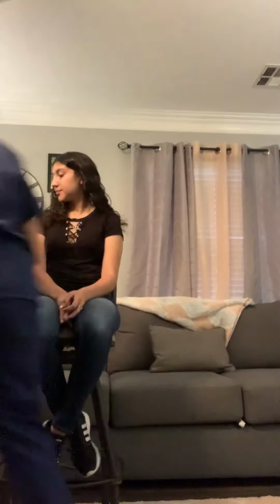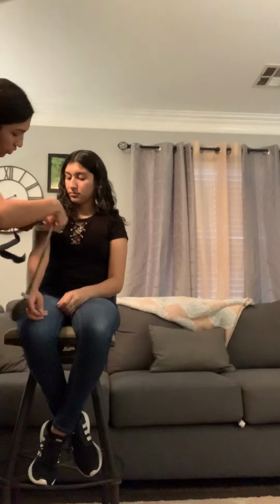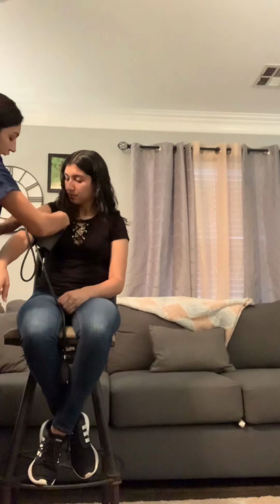Now we are going to do your blood pressure, Amber, and we are going to do it 2 different ways. First by palpating, and then I'm going to listen with my stethoscope. I'm going to feel for your brachial artery and align the cuff about 2 inches above where I feel it. Thank you for lifting your sleeve for me. We want to make sure to have the right size.